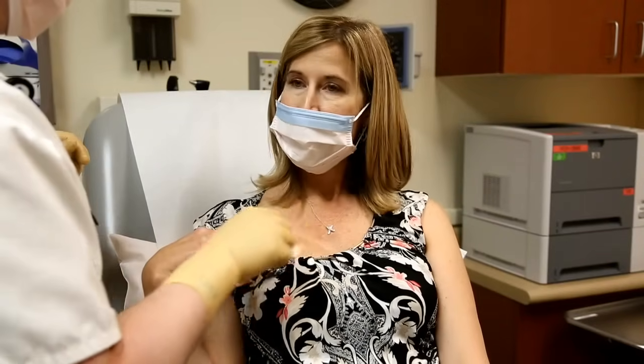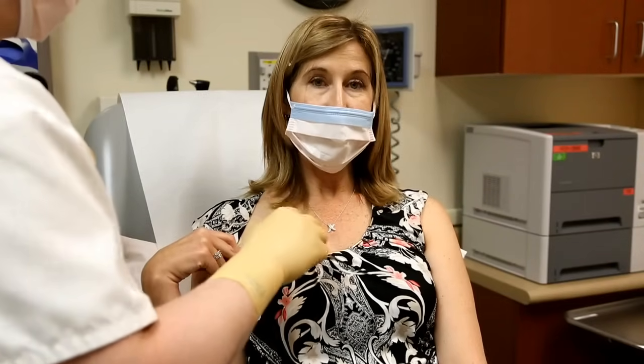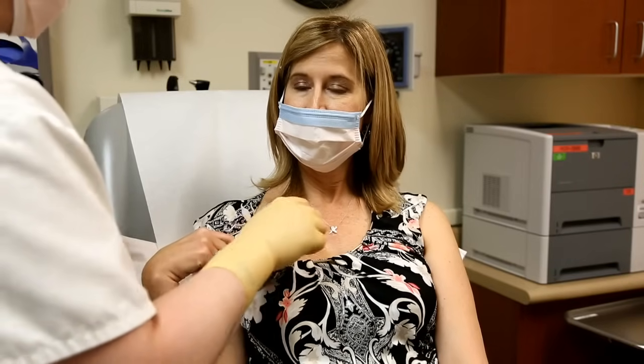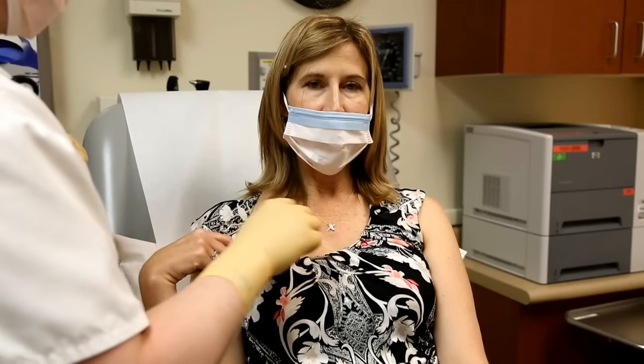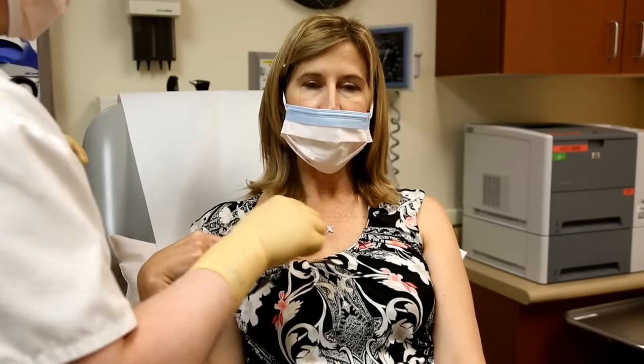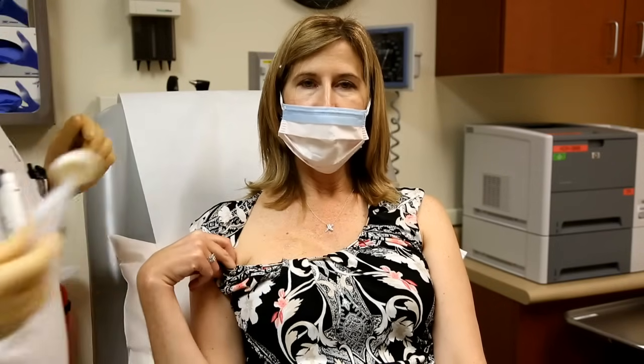Which side are we using today? Today we're going to do — I have a double port — so today we're going to do the medial. Every other week I switch over which side we're going to access, so that we don't ignore one side entirely, and that way both will continue working properly.